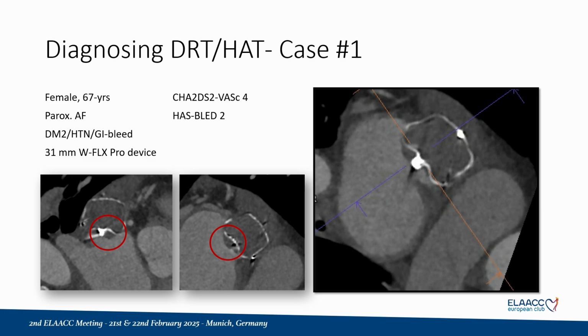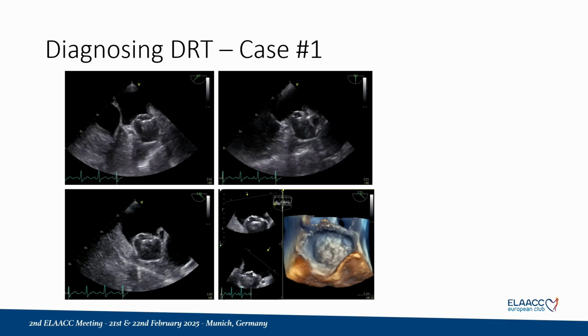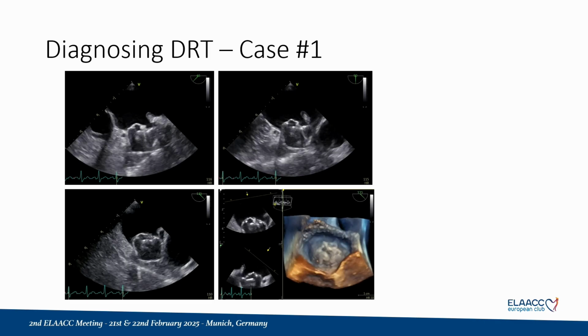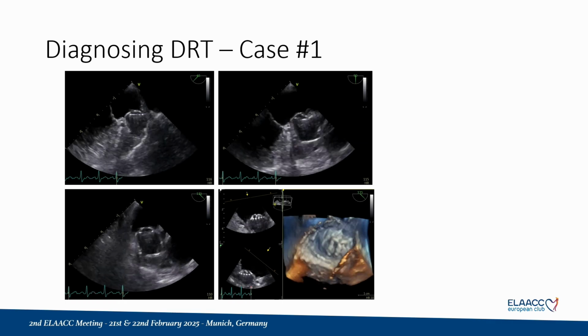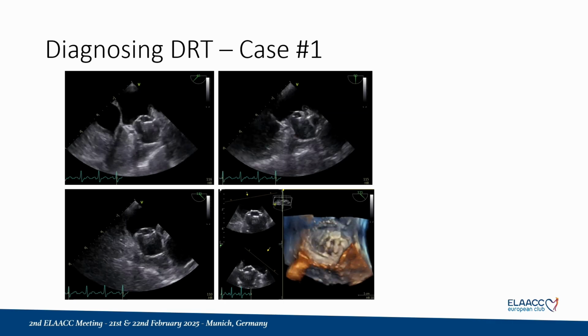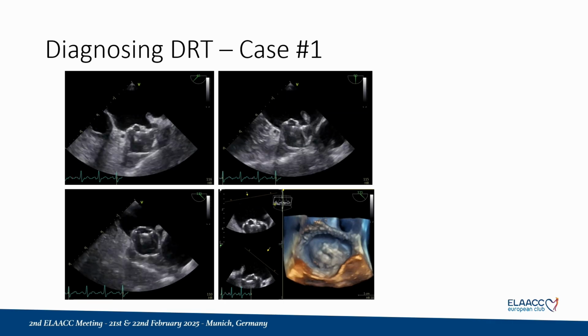subfabric. So we did a TOE. So TOE cannot be completely replaced. But as you see in these TOE images, the membrane of the device is asymmetrically protruding into the lumen of the left atrium. And clearly the changes we saw on CT were subfabric hyperattenuation.